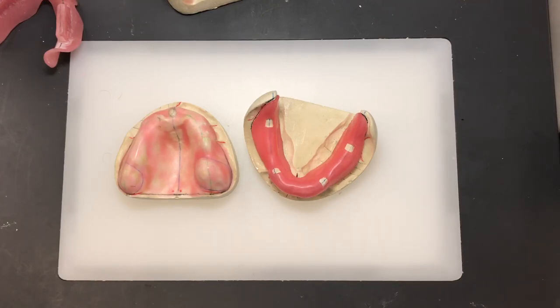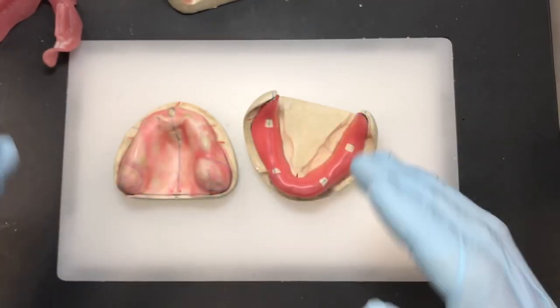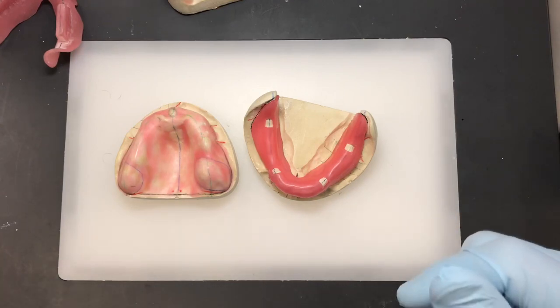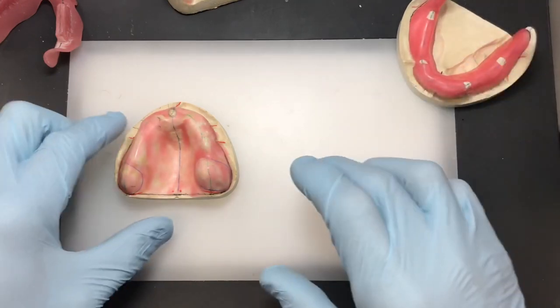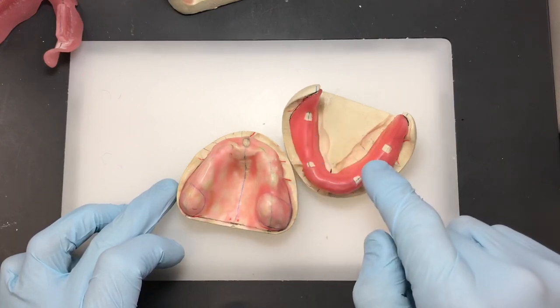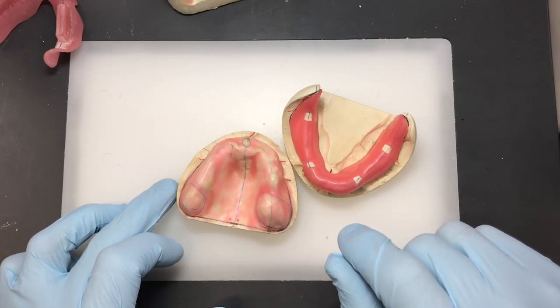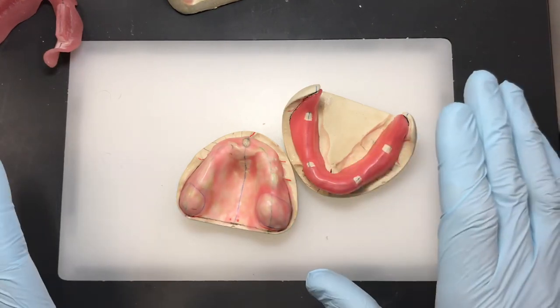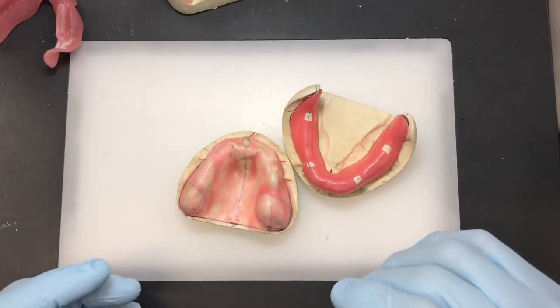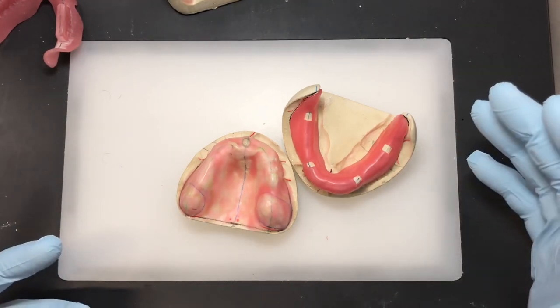Always apply a little bit of Vaseline on your gloves because the material tends to be a little tacky. With a fine layer of Vaseline on your fingertips, you'll be able to apply the material without it peeling back as you lift your hand. Start with the upper tray first — it's easier. The lower one has a different handle design with three variations, and I'll show you all three so you can decide which is best for your scenario.